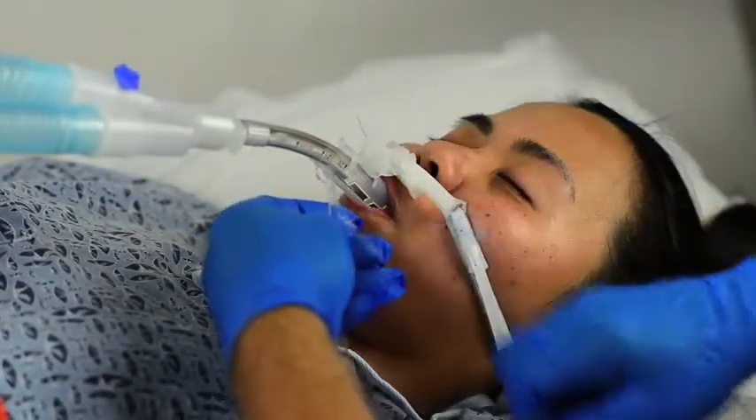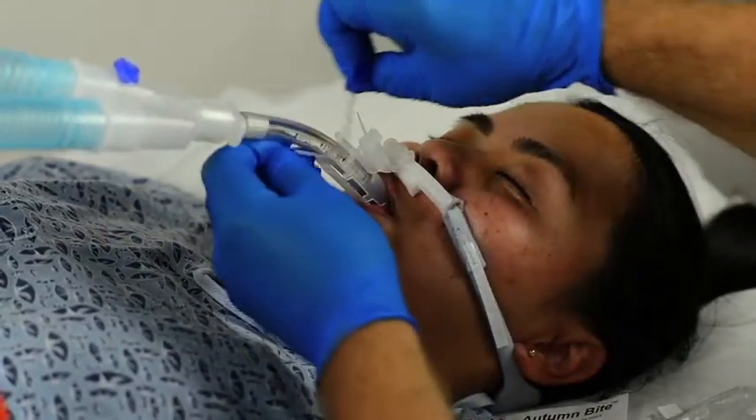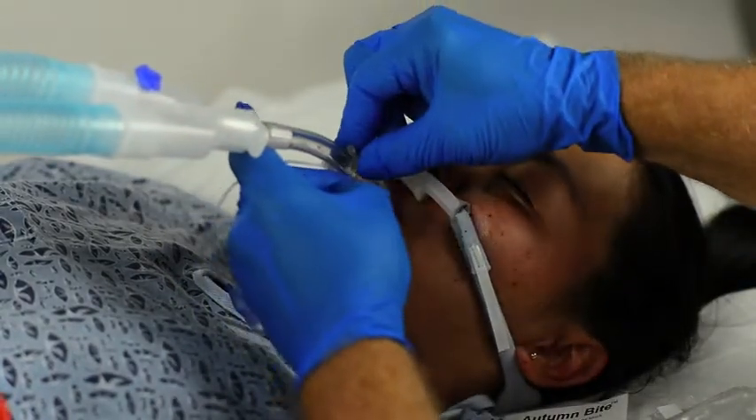Remove the bag from the Autumn Bite, tighten the tube connection, and confirm the ET tube is secure within the Autumn Bite. This completes the procedure for securing the bite block with the ET tube strap fastener technique.